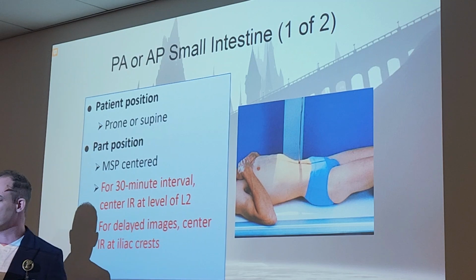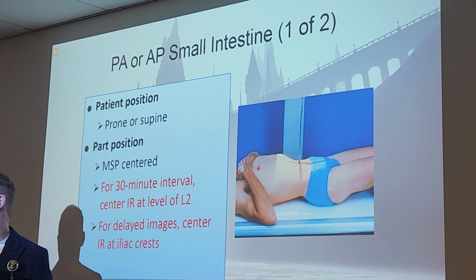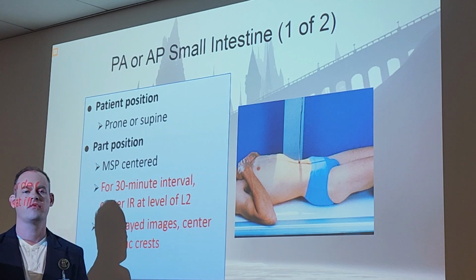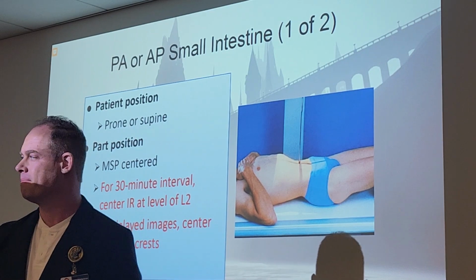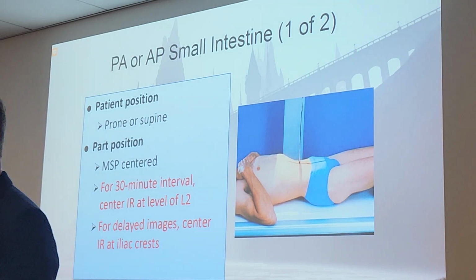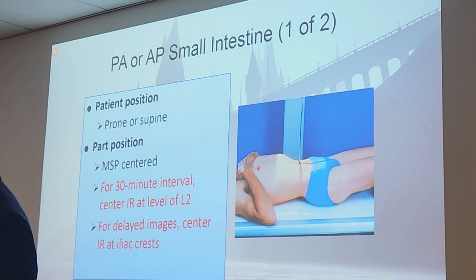That's because that's approximately when the barium's in the stomach and the C loop, and it's going to give them a better visualization of that area without it being cut off. Big star on that. That's a great question. It's higher at the 30-minute interval. You're talking about the third film technically, because you do a scout, 15 minute, then 30 minute.